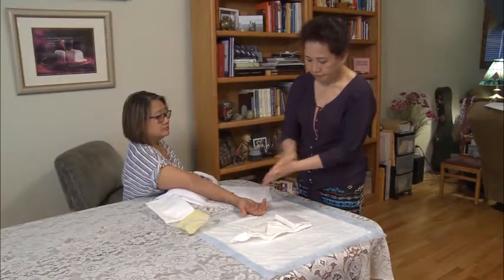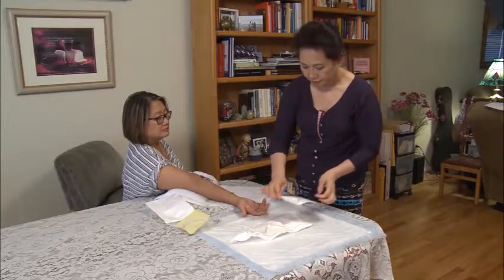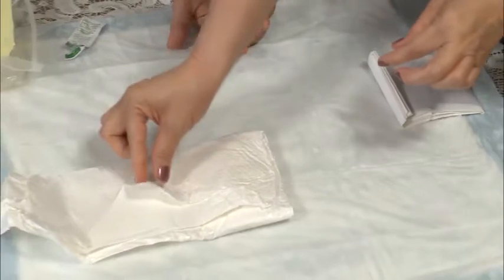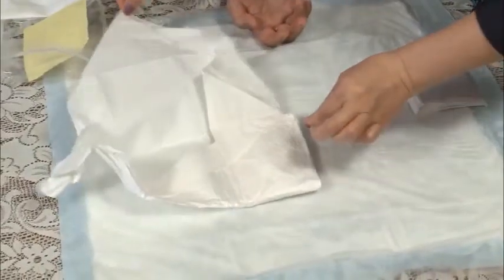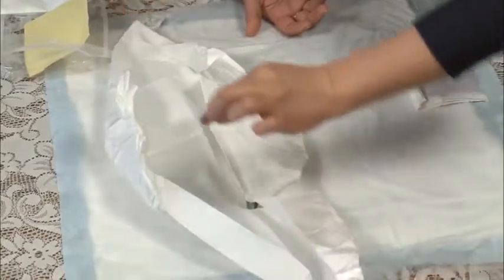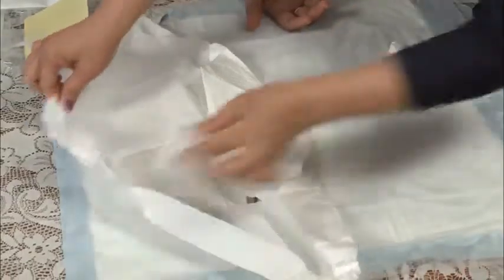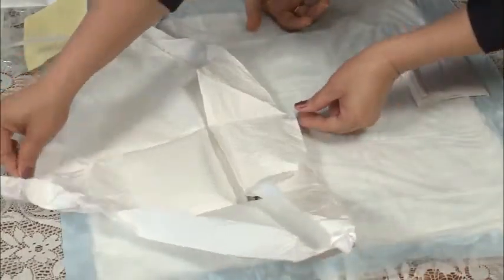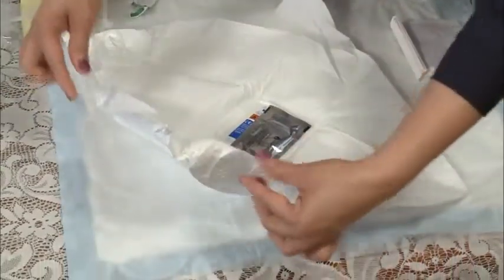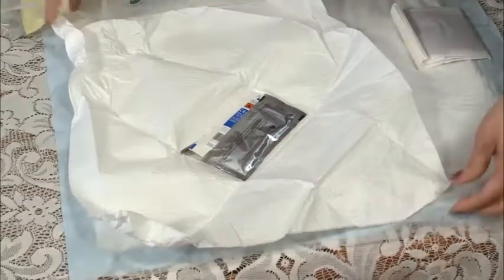Pick up the sterile glove package and place it away from the rest of the kit. Then continue opening each corner of the wrapper using only the outside corner edges of the wrapper and pull all 4 corners away. Remember that you cannot touch anything inside the sterile field with your bare hands. If you forget and touch, you have contaminated the contents. Throw that kit away and open a new one.